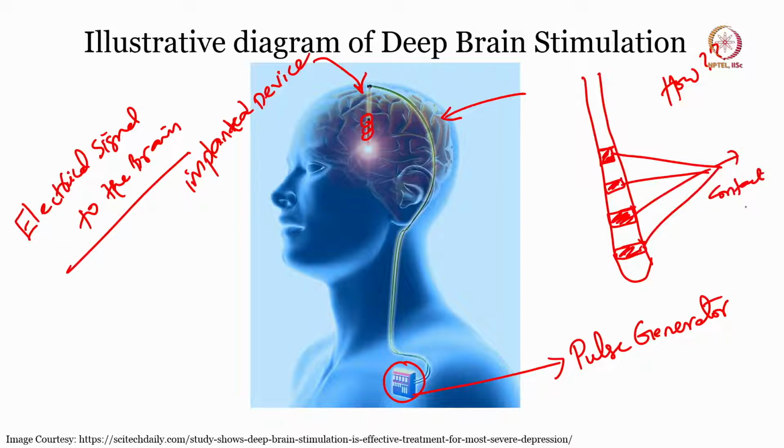All these four are contact pads, and internally there are wires. Of course, all the four are not short circuited. Understand that, otherwise it is not going to work. So, there are four contact pads that we can see, and internally there are wires, and here there is a connector. Somehow all the four contacts are taken like this through a wire.